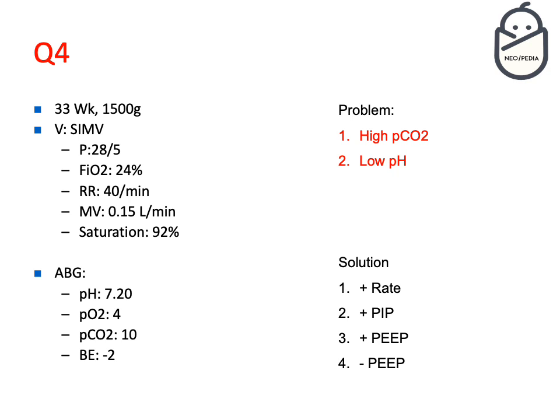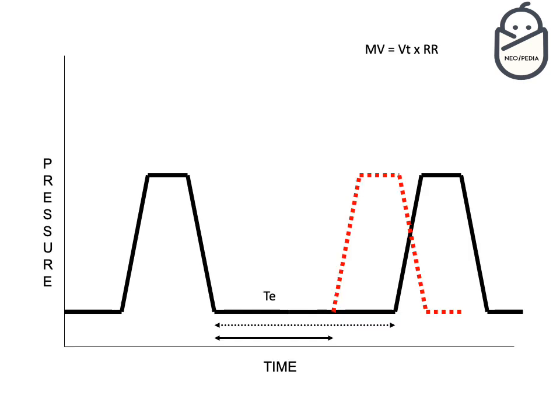the best thing to do in this condition is just basically increasing your rate, okay? Because if you increase your rate, you're going to increase the number of these cycles here, up and down. You can see all these curves, okay? So you're going to add more curves. So basically, you're going to improve your CO2 removal, because you're giving more frequent clearance for the CO2, okay?